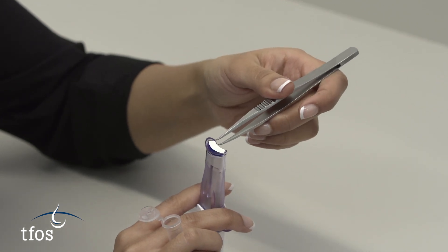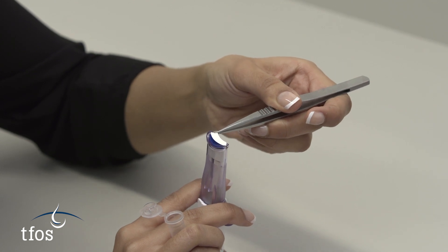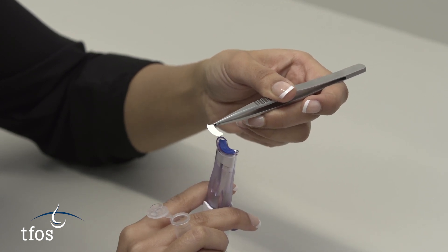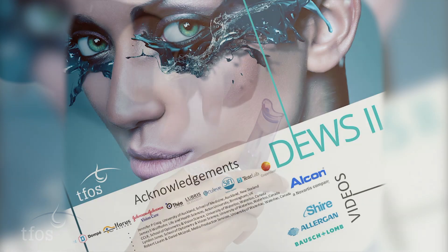The filter paper is grasped between forceps and the plunger fully depressed in order to release the sample. The filter paper is then transferred to a sealed tube containing storage solution that is appropriate for the desired analysis.